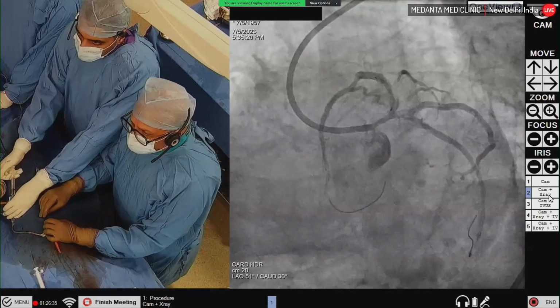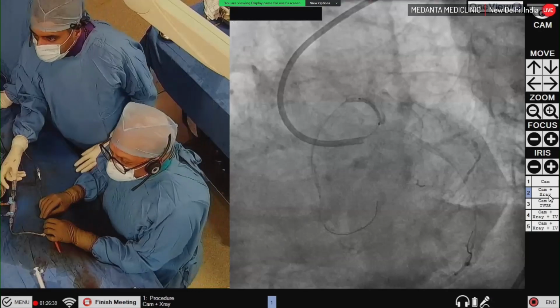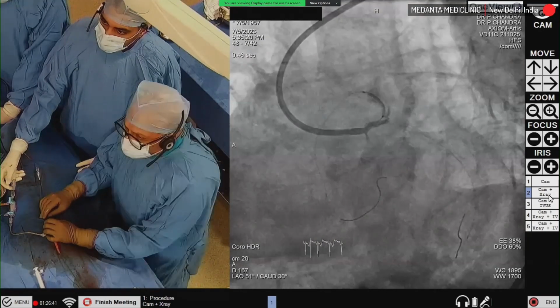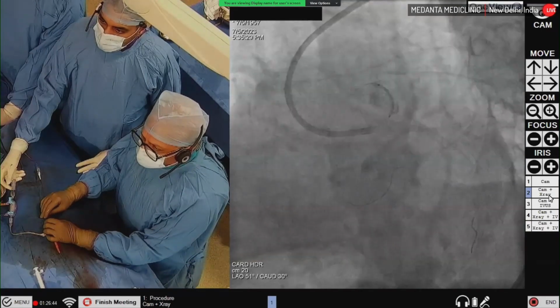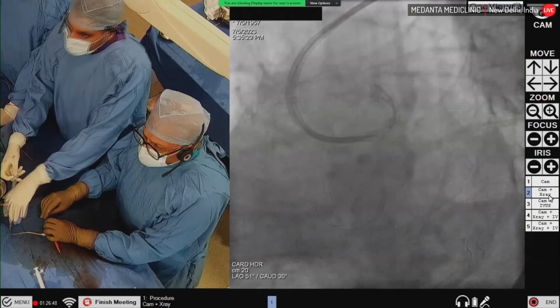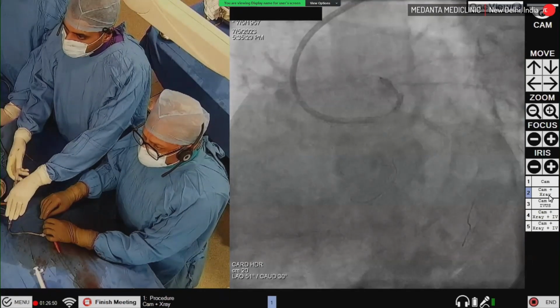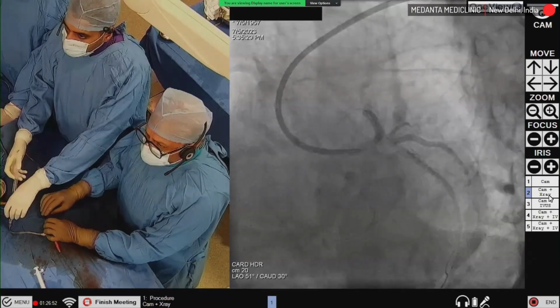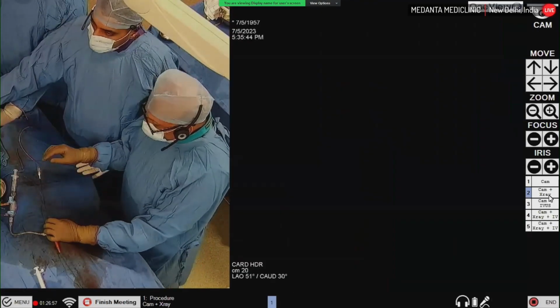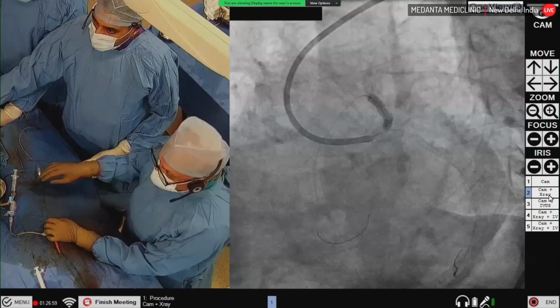Check. I think we should be okay. Okay, go up here. 1, 2, 3, 4, 5, 6, 7, 8, 9, 10, 12. Deflate.